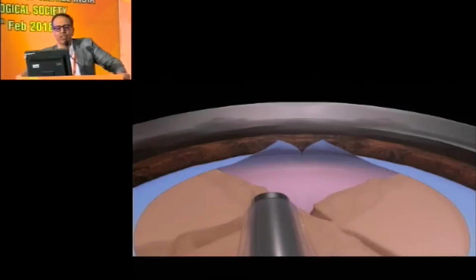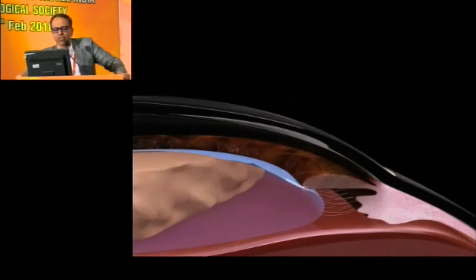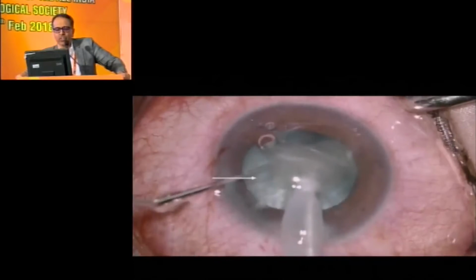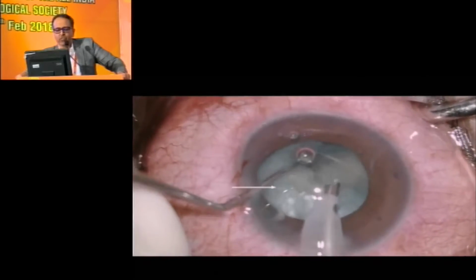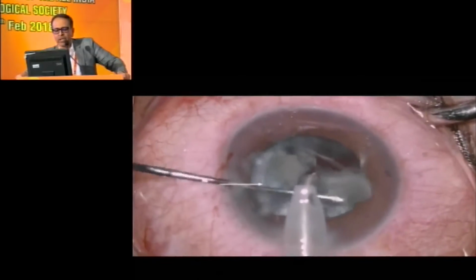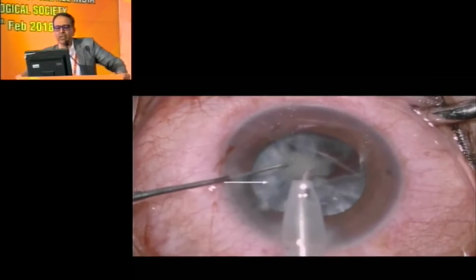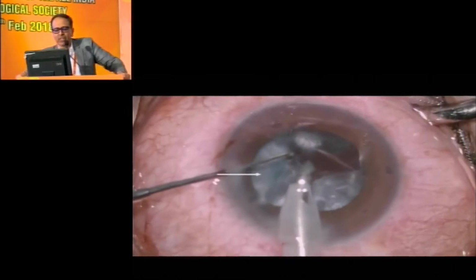If the flap is everted and fluttering, mark my words, it's pre-equatorial, because the short length of the flap is responsive to the anterior segment fluid dynamics and it flutters. I would like you to focus on the trypan blue stained anterior capsular tear. If it is fluttering and everted, for sure, if you continue with safe phacoemulsification techniques, it is pre-equatorial. There is no need to be in a state of dilemma.